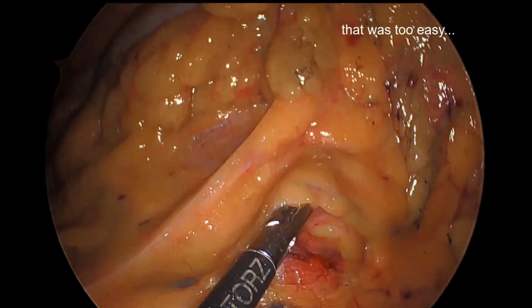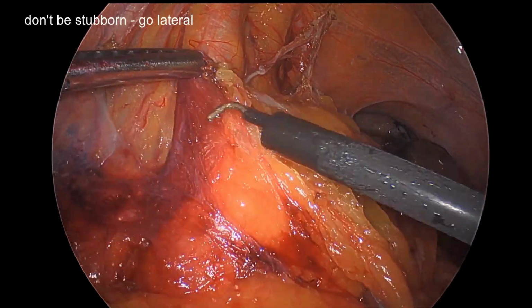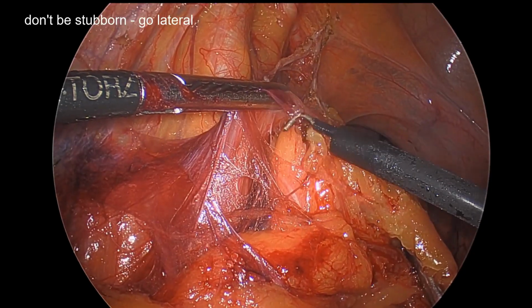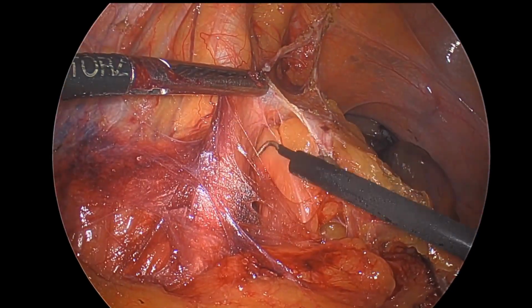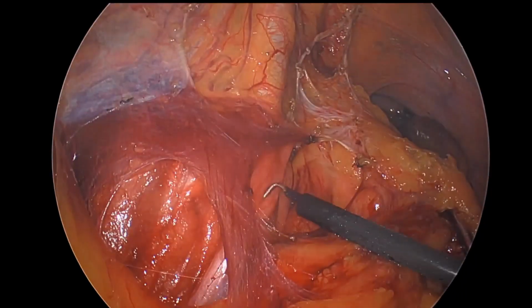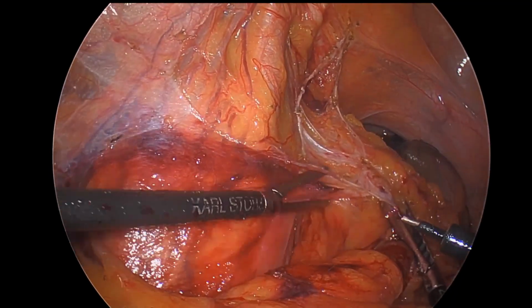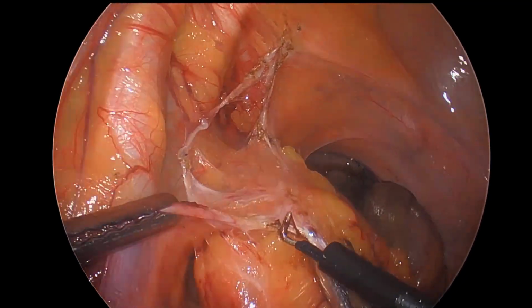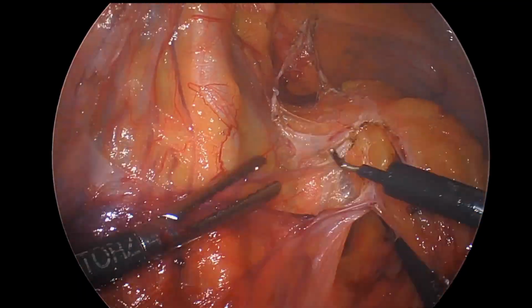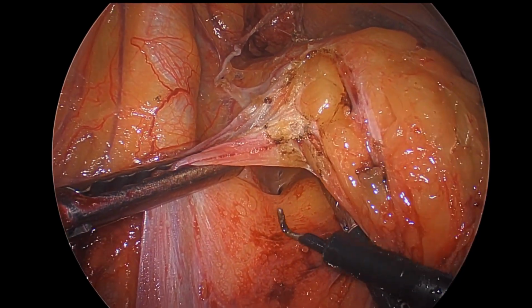So this is the time not to be stubborn, and it's time to go lateral. So here we've gone lateral. You can obviously see we've done a bit more dissection that I've edited out for sake of time. Here we're taking off all the remaining lateral attachments. You can see the ureter there, and you can see these sidewall attachments. This patient, again, we're doing low anterior resection for cancer, but the patient must have had some episodes of diverticulitis or has some congenital adhesions in that plane.